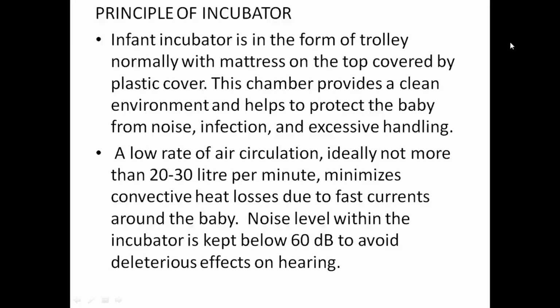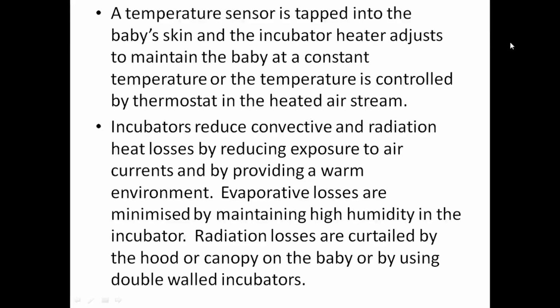A low rate of air circulation, ideally not more than 20 to 30 liters per minute, minimizes the convective heat losses due to fast currents around the baby. Noise level within the incubator is kept below 60 decibels to avoid deleterious effect on hearing. A temperature sensor is taped to the baby's skin and the incubator heater adjusts to maintain the baby at a constant temperature, or the temperature is controlled by a thermostat in a heated stream.